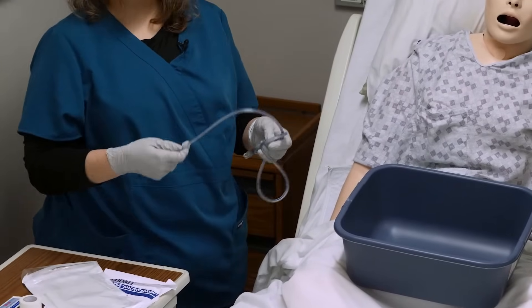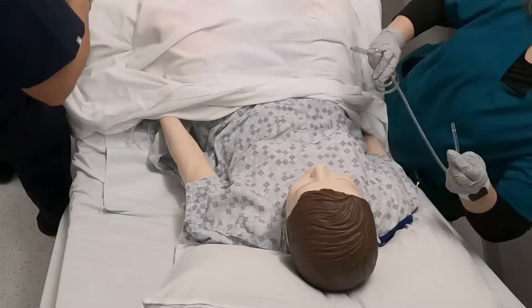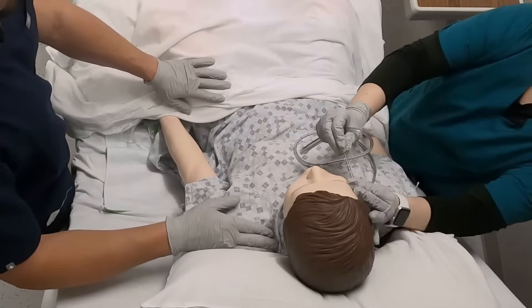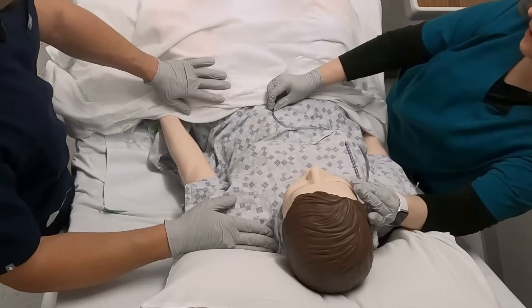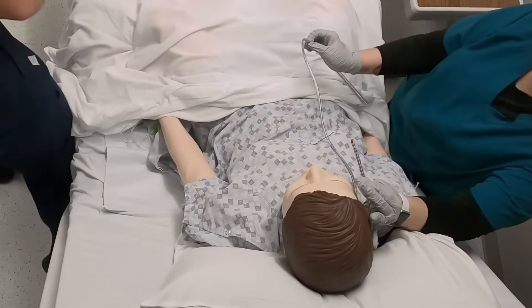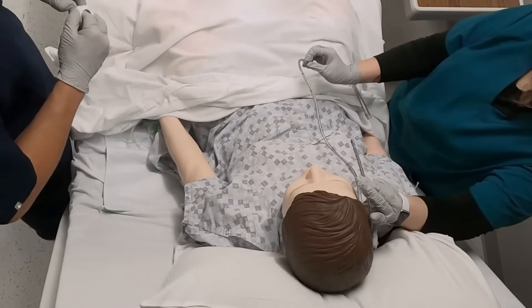The next thing I'm going to do is measure it. I'm going to measure from the end of the nose, around the ear, and then down to the umbilicus. I want to mark this because there's a good chance I'm not going to remember where that mark actually is. This is where I'm going to stop pushing the tube in.